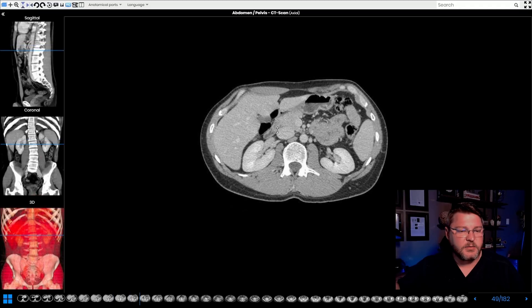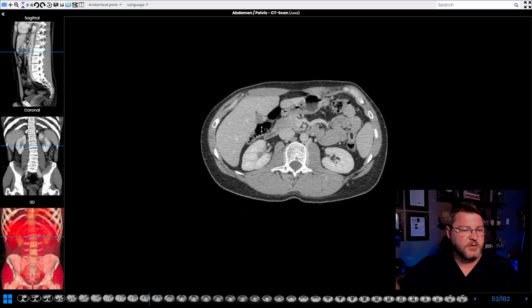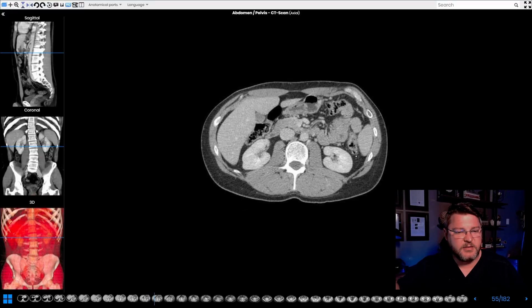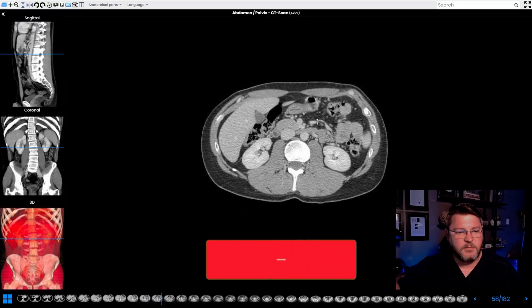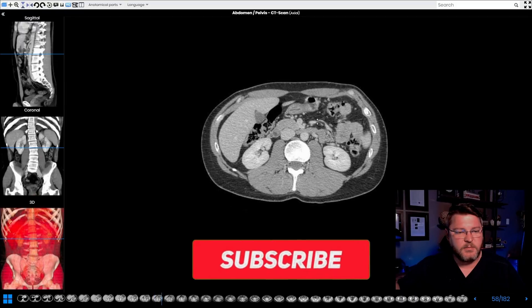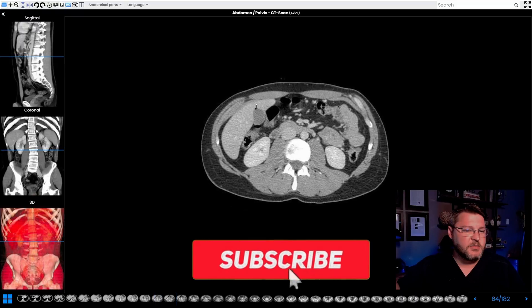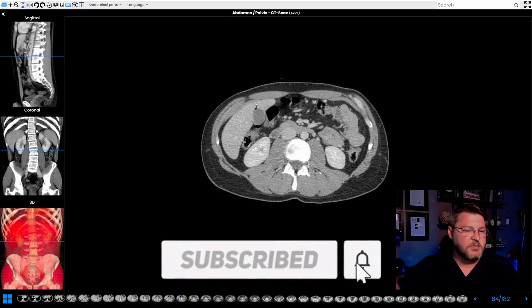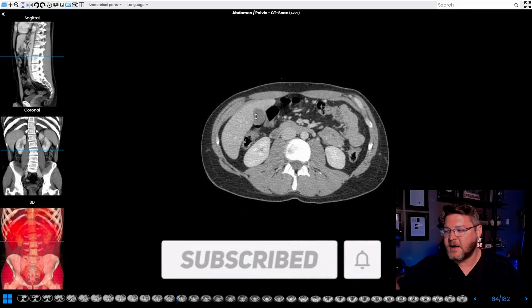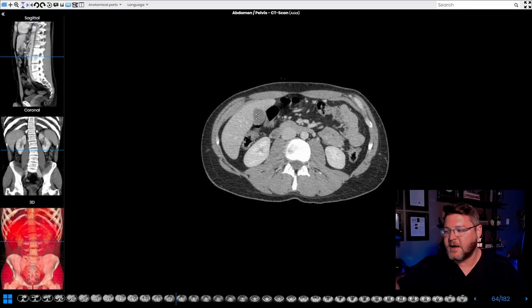As we continue to scroll down, these black areas are air inside of the abdomen — most of these are in the small bowel. As we continue, you see this dark spot right over here; that right there is the gallbladder.